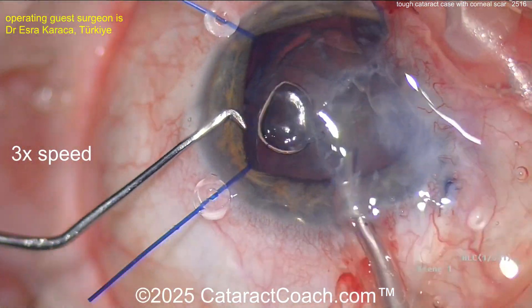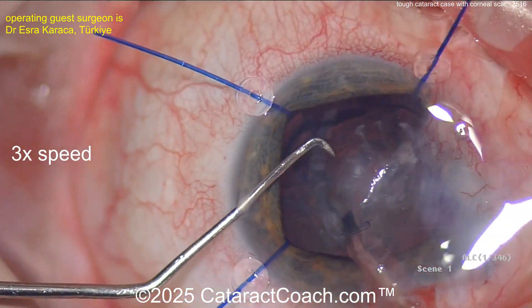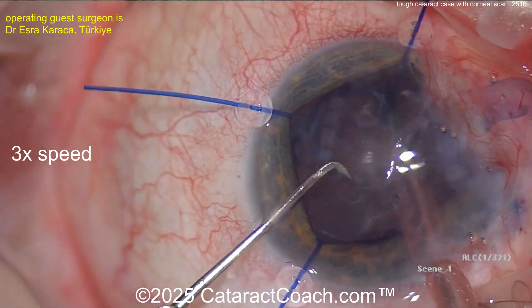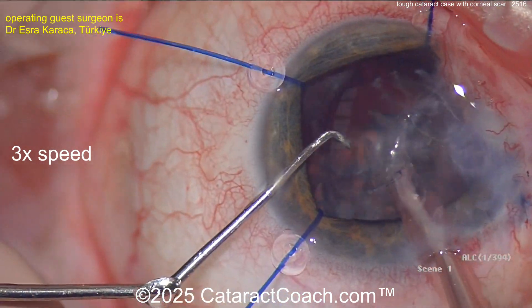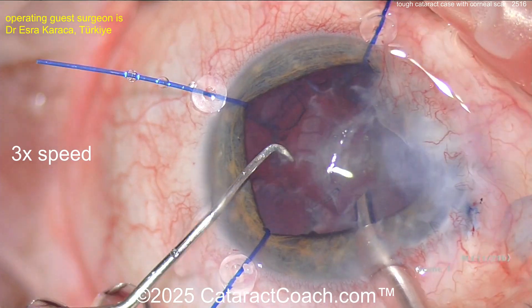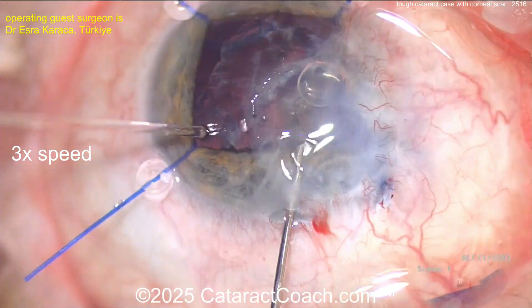I would get the nucleus out of the capsular bag, and then it'll be a lot easier to implant the IOL. It's not a very dense cataract — emulsifying it here. There's a very limited view but sufficient to perform the cataract. Just get that chopper in the safe position at the end to make sure you don't get the capsule coming up.